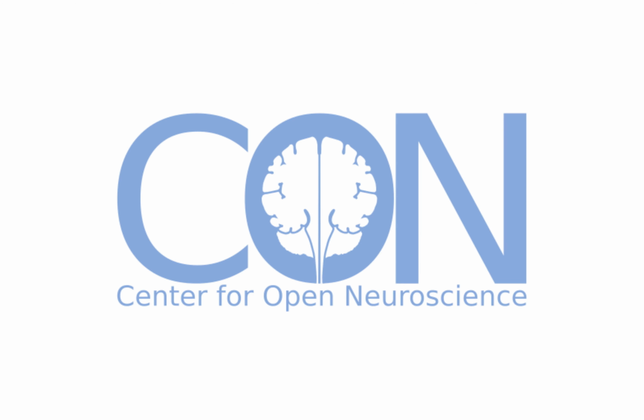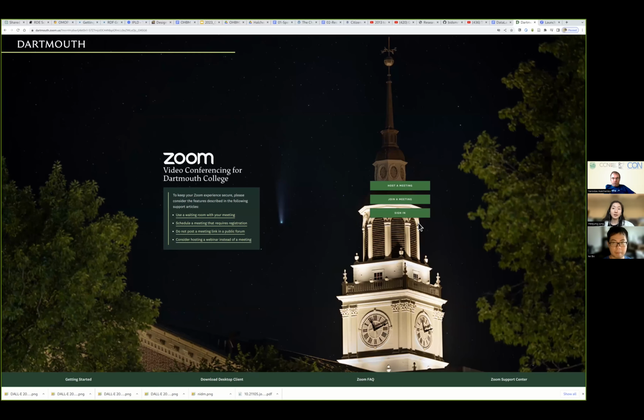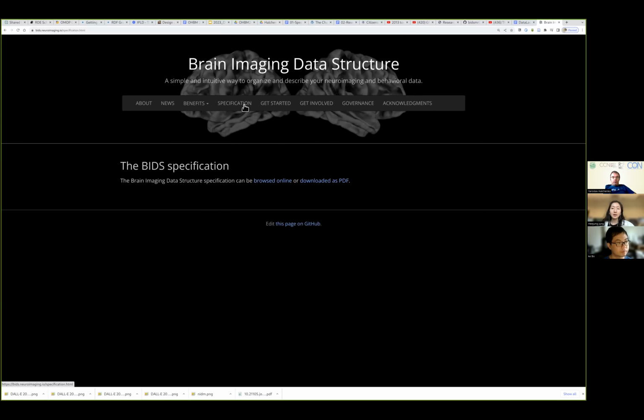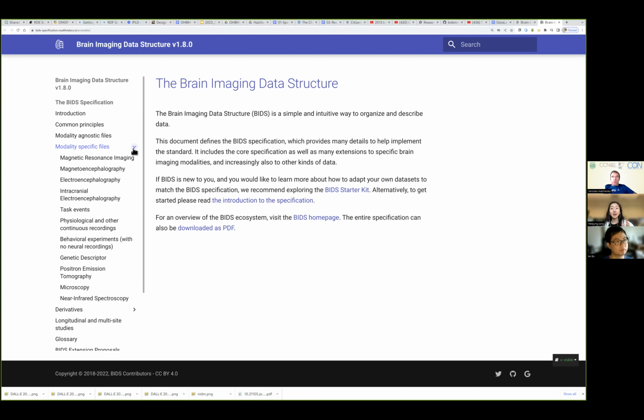Yeah, we went to the BIDS specification and looked at all the entities. I think one unique problem that Ke has is that the data set has more modalities than we would normally collect in a DBIC scanner, because we only collect DWI, anatomical and EPI data. But this one has MR spectroscopy or something else, and we were trying to get some answers, but we're hitting a bit of a roadblock because ACQ was just a label.